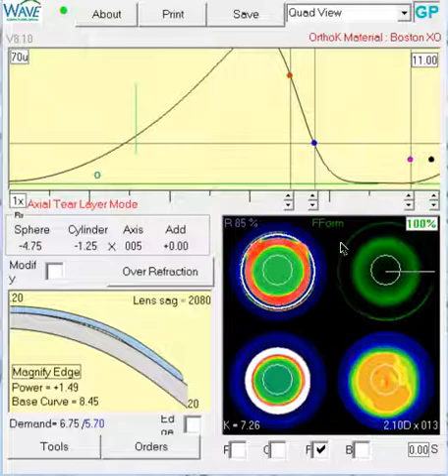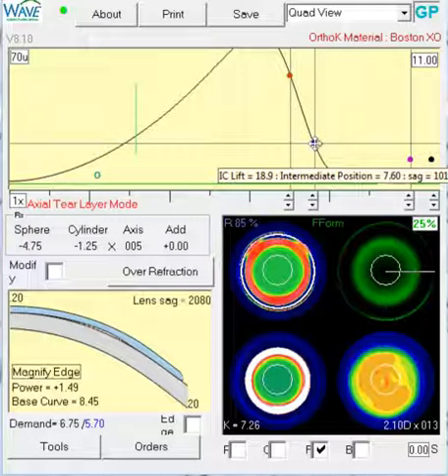The next thing we'll do is adjust the sagittal depth of the lens to see if we can mold out a little bit of that residual cylinder. So let's aim for about 15 microns since we're trying to get rid of with-the-rule. What we're going to do is flatten the lens horizontally and then steepen it, or increase sagittal depth, vertically. Freeform, so we'll do 25% mode. Right now we're at 1013.